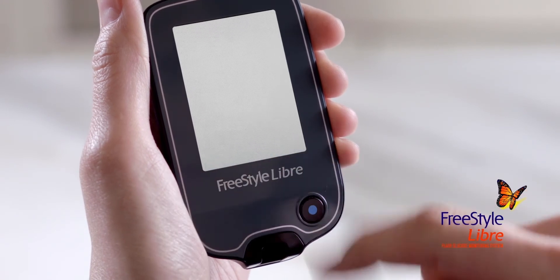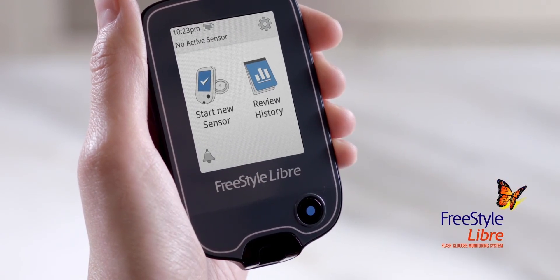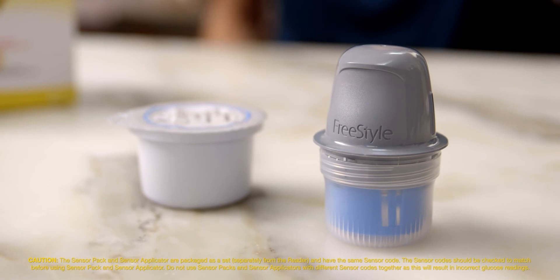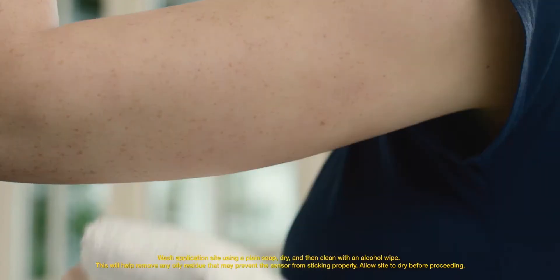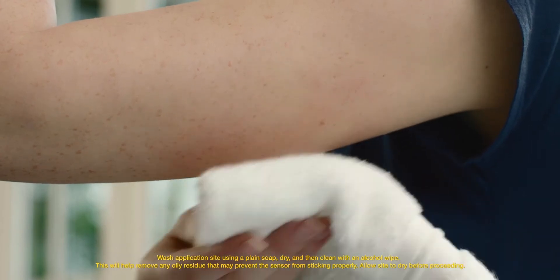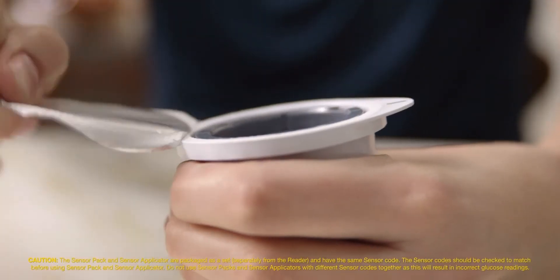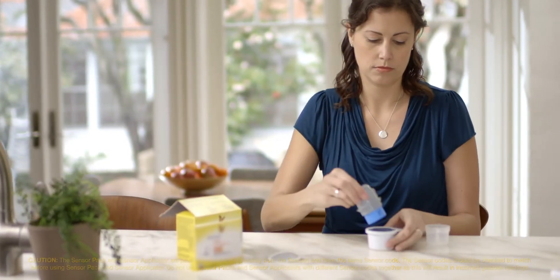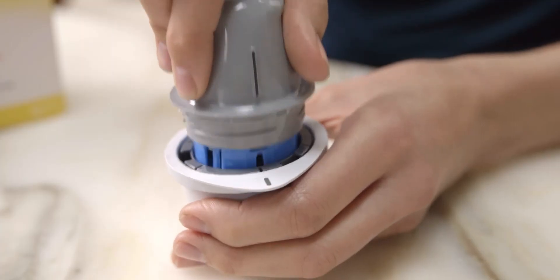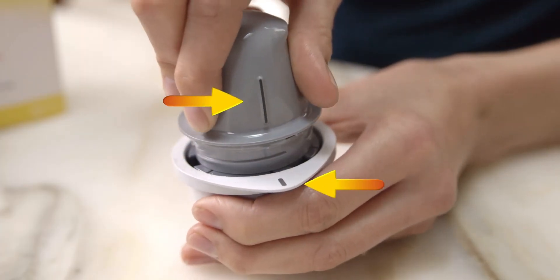How easy was that? Putting on the sensor is just as easy. The FreeStyle Libre sensor kit comes in two parts: the sensor applicator and the sensor pack. Select the site on the back of your upper arm, clean it and let it dry. Peel the lid completely off of the sensor pack and unscrew the cap from the sensor applicator. Place the sensor applicator into the open sensor pack and line up the dark mark on the applicator with the mark on the pack. Then press down firmly on the sensor applicator until it comes to a stop.